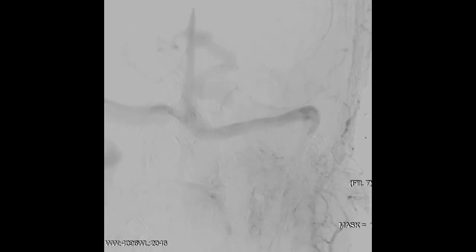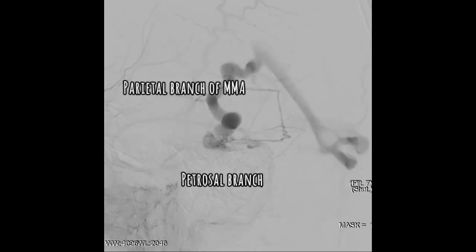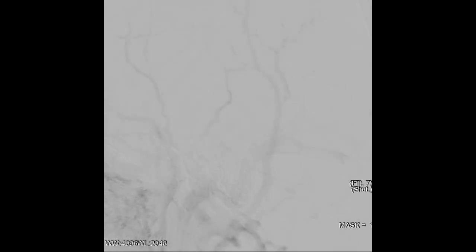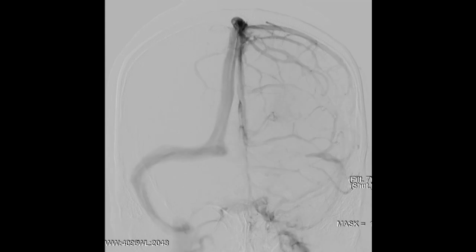In this video, we discuss the management of a petrous dural AVF. You note that the dural AVF is supplied with the petrosal branch as well as the parietal branch of the left middle meningeal artery. The meningo-hypophyseal trunk also contributed to the dural AVF supply.